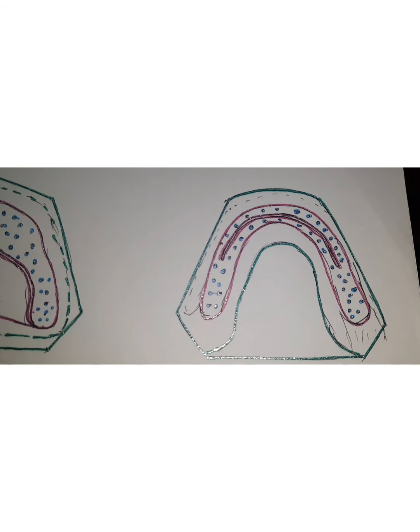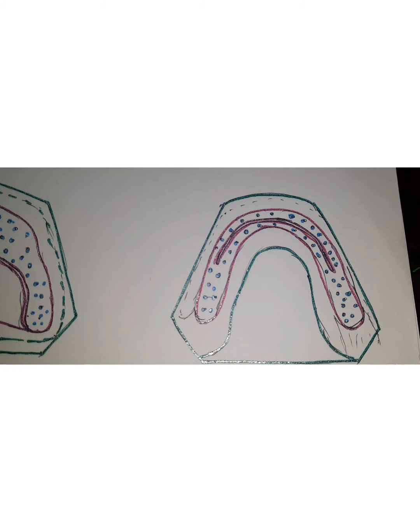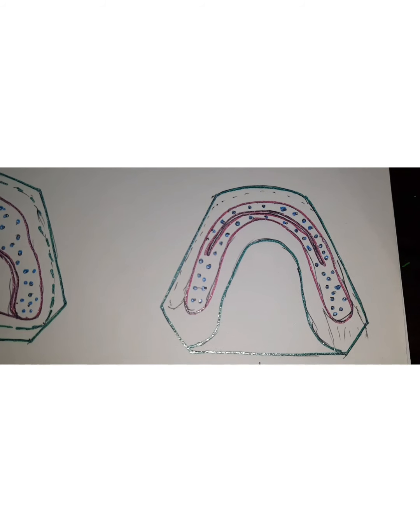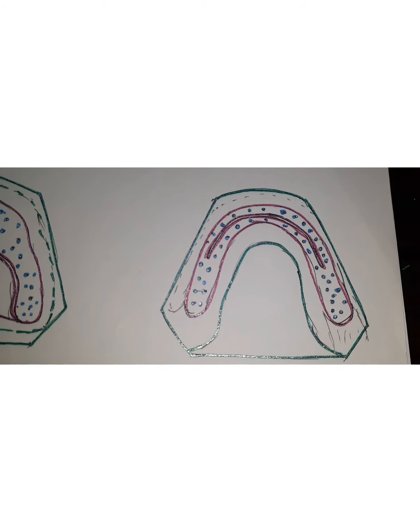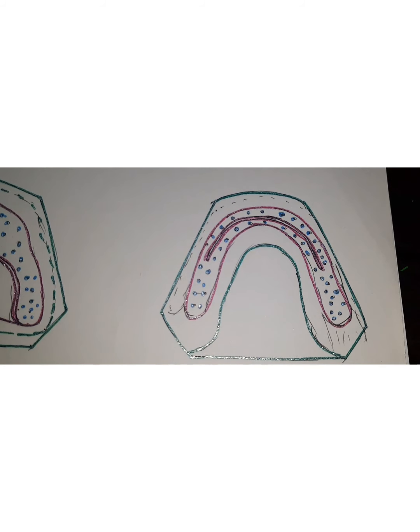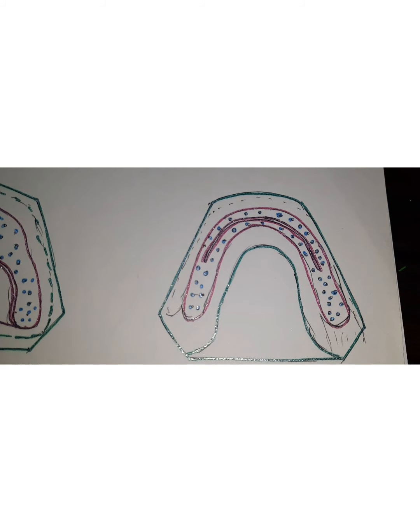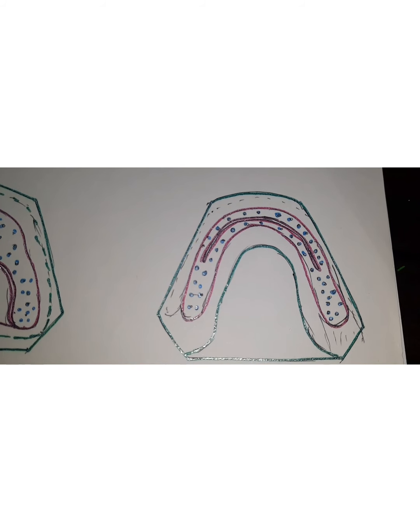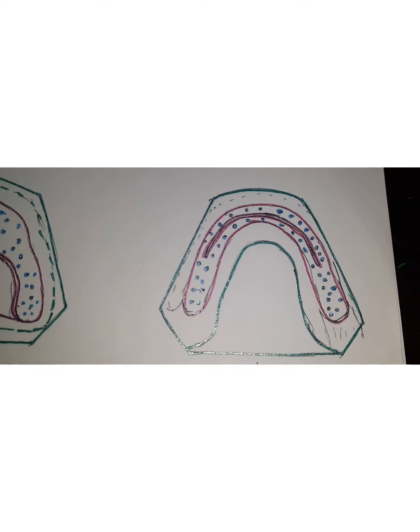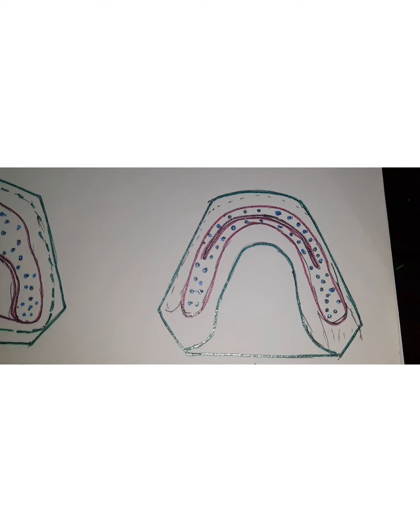There are obvious advantages of using metal denture bases because they have high strength, because rigidity is great because of high modulus of elasticity, and they have increased accuracy because you have a direct contact of metal surface with the tissues, and there are less chances of tissue change under the metal base, lesser porosity, and because of the casting, the flow of the metal, and therefore because of the high polishability it is easy to clean. They have better thermal conductivity.